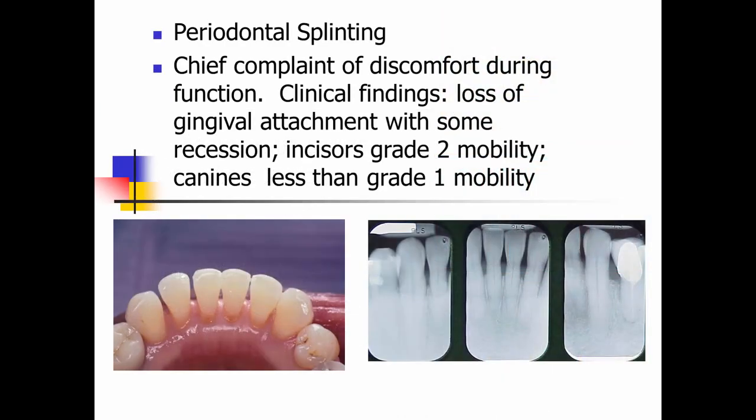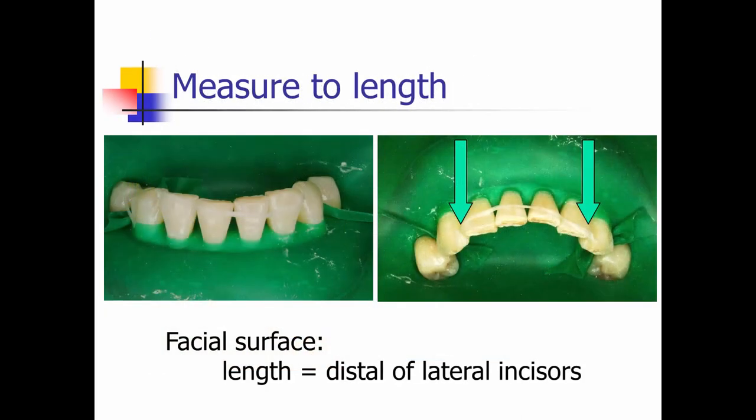Let's take a look at some cases. For this patient, we're going to do periodontal splinting. Their chief complaint was discomfort during typical function. Clinical findings showed loss of gingival attachment, some recession, the incisors had grade two mobility, and the canines less than grade one. Radiographic images showed approximately 35 to 40 percent bone loss. Our decision is to splint the teeth. We place a rubber dam to isolate — these are adhesive procedures. I use dental floss placed on the facial to measure the length of fiber ribbon needed, from the distal of the lateral incisors, extending to the mesial of the canines on the lingual of these mandibular anteriors.